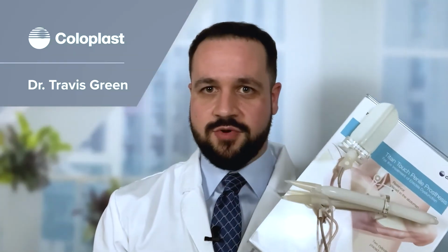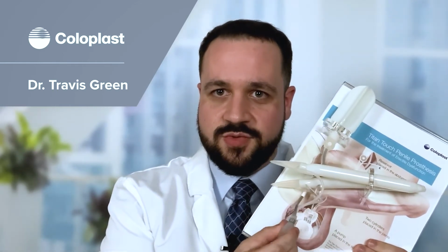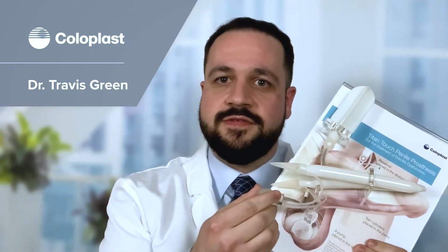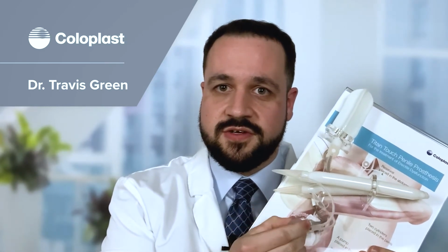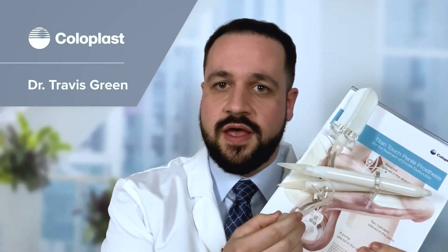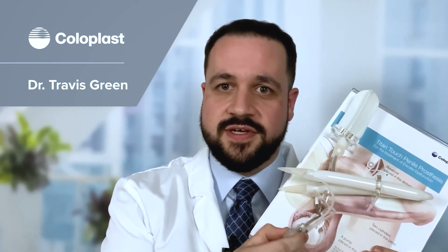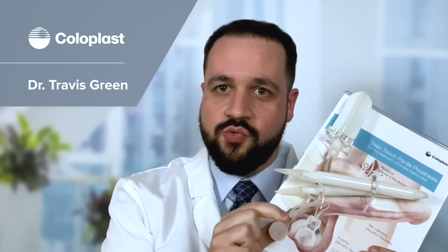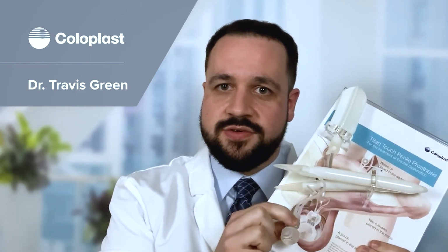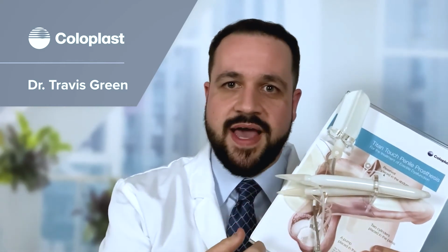The 3-piece inflatable penile prosthesis is actually very easy to operate. So first you have this pump that sits inside of the scrotum next to the testicles. This is just where you press to inflate the cylinders in the penis. You just continue to push this until the cylinders are completely rigid and you're satisfied with the erection. You can't really over push this pump, so don't be scared to keep pressing. And then you have the release valve, which is controlled with this button right above the pump. So to release the erection, you just hold down on this button and the erection releases, all the fluid moves back out of the cylinders.